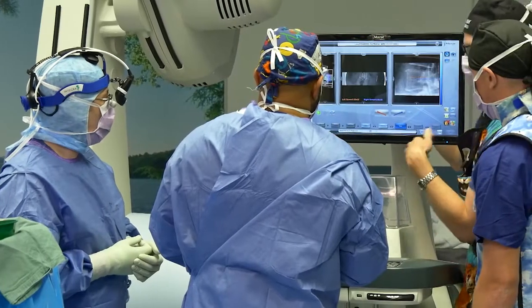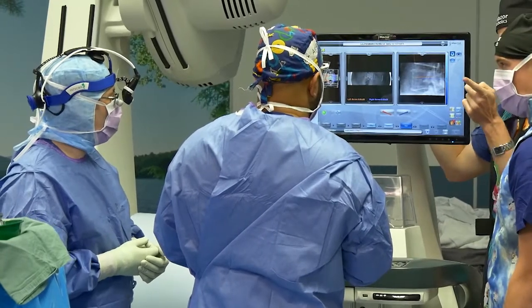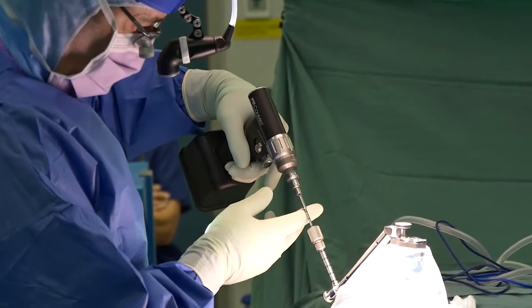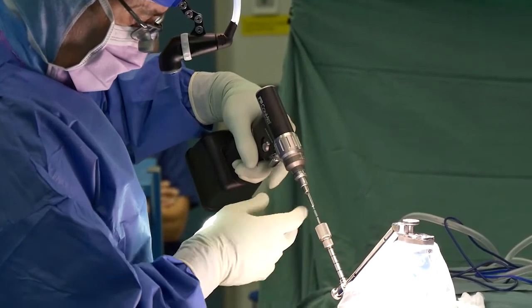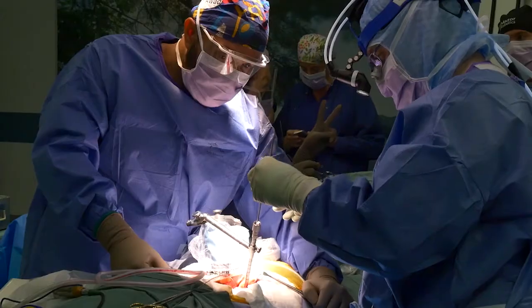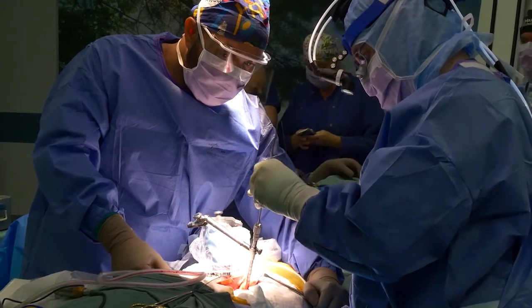The third step is to use the robot to guide the surgeon to exactly the right starting point. Then the surgeon can drill holes in the correct position and at the correct angle. But this is not an autopilot procedure. The surgeon needs to feel the texture and resistance at the end of the instruments to make sure that they don't go off course.